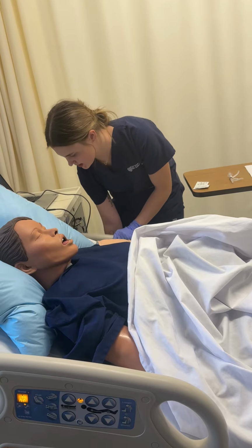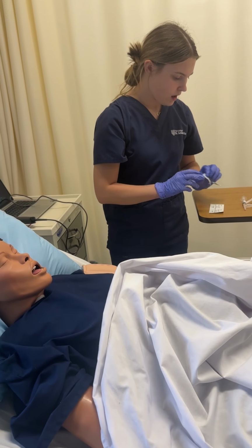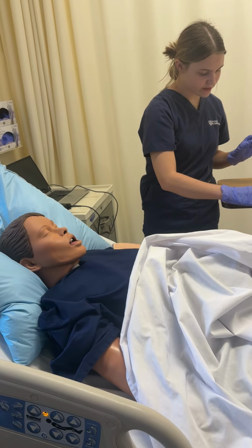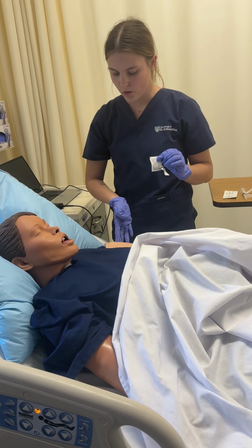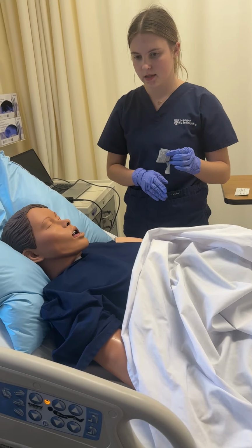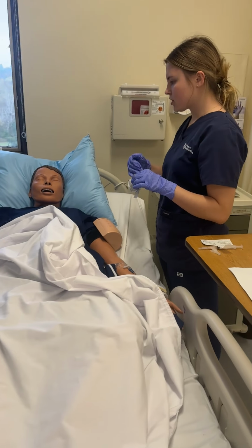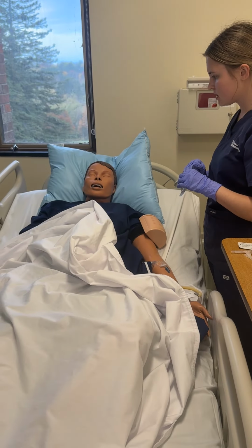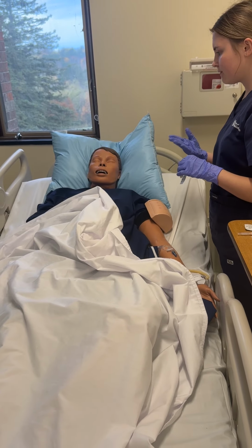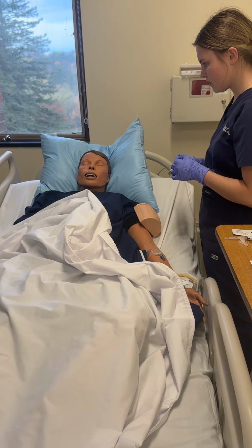And we're gonna pull this down so we have better access. So this first shot is going to go into your deltoder, and some side effects that we want to look for is just redness and swelling at the site, and then you also might feel fatigued and have a headache the next day. Does that sound okay?